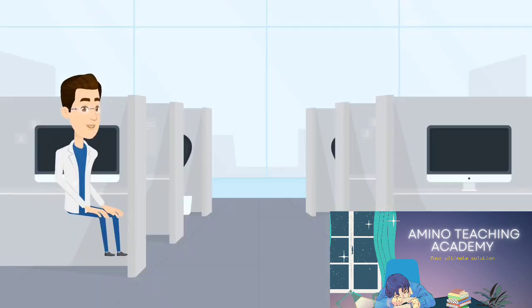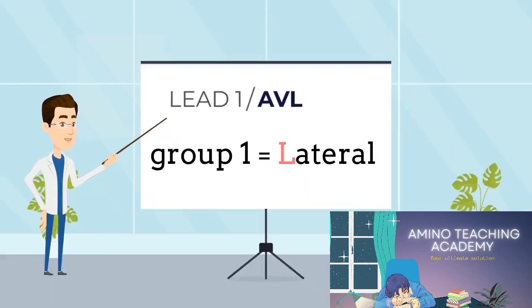We are going to group the leads into 5 groups, keeping in mind that we have 11 leads remaining. Hence each group will have 2 and one group will have 3. Let's start with group 1. This includes lead 1 and AVL. They correspond to letter L, which stands for lateral. So ST segment elevation in these leads corresponds to myocardial infarction in the lateral wall of the heart.